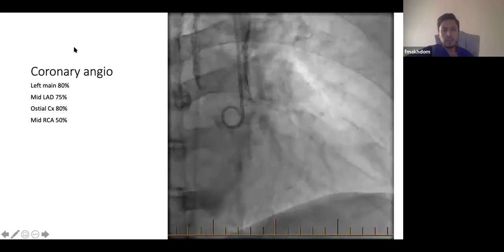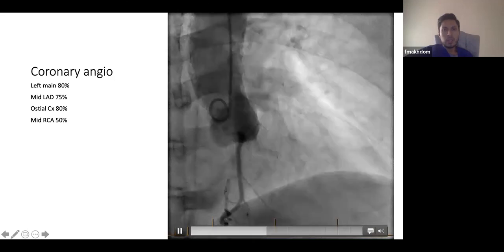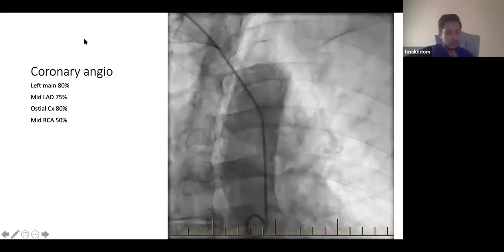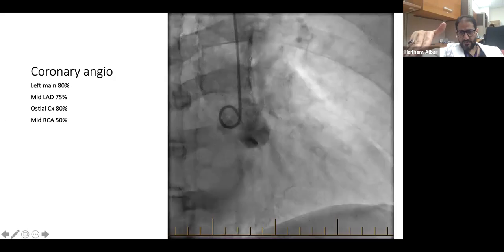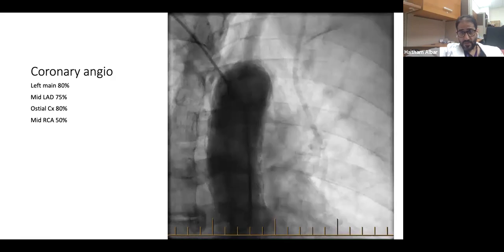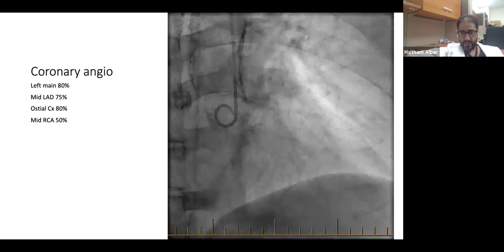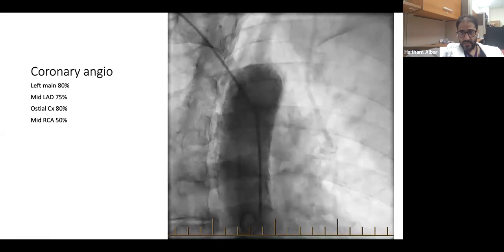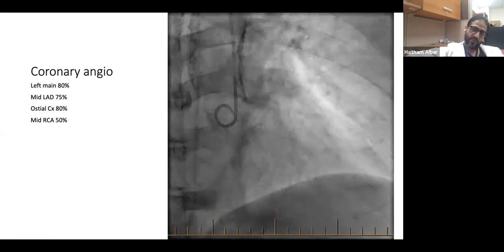Finding coronary, he has multi-vessel disease as written here, and the aorta as seen. Can you describe the aorta? Okay, this is an aortogram showing, actually, a normal aorta, for me. No evidence of dissection, no evidence of dilatation, and I can see the coronary cusps. Actually, the three of them, or at least the two of them.